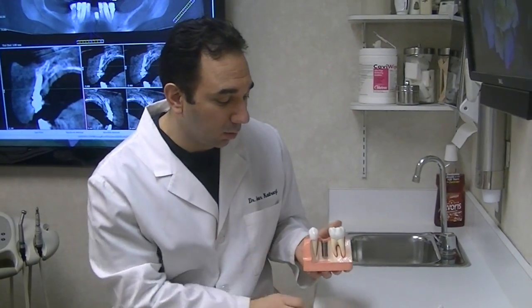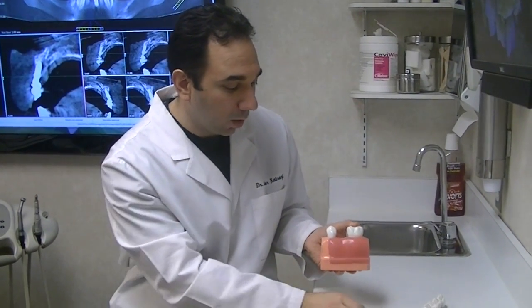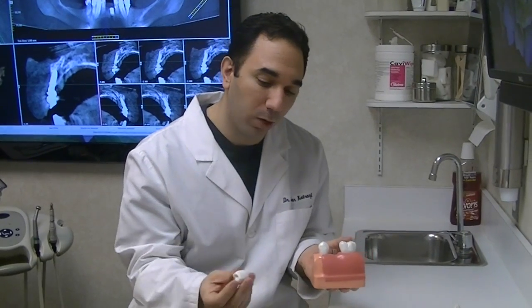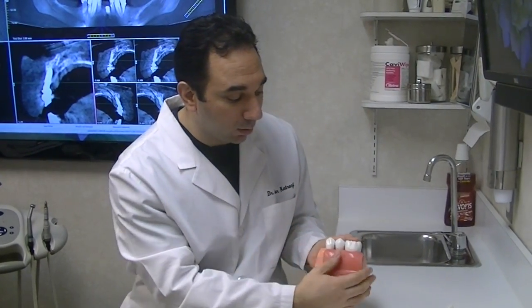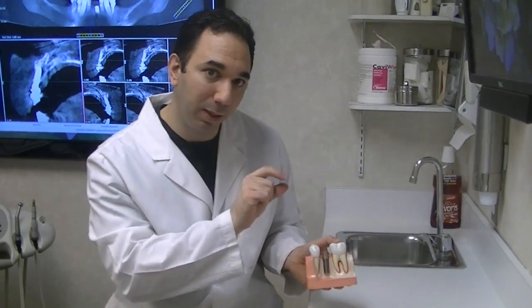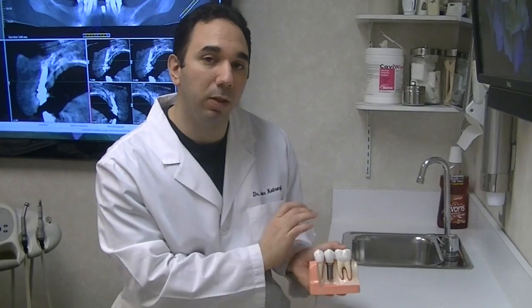When it finally anchors into the bone, it will be ready for a tooth. Your general dentist, or your restorative dentist, will place an abutment — which is an attachment to the implant — and that allows for a crown to go on top. So there are three parts to the implant: the implant itself, which we typically place here; the abutment, which attaches the implant to the crown; and the crown, which is typically done at your general dentist's office.